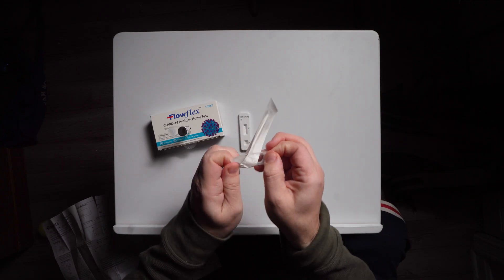I'm going to open up this swab. We're going to take this and swab it around the nose for about 15 seconds in each nose, making really big circles.